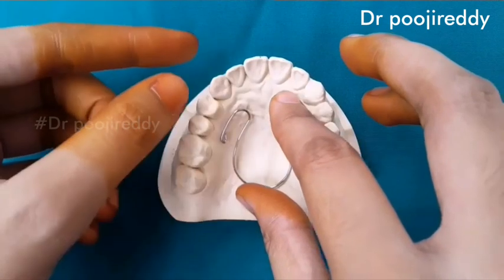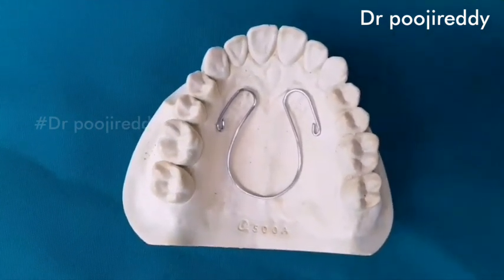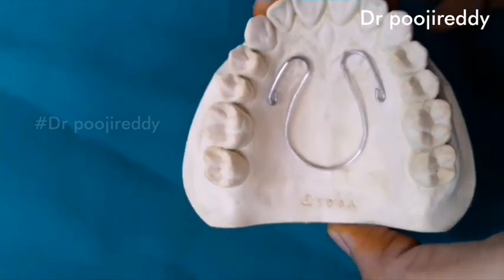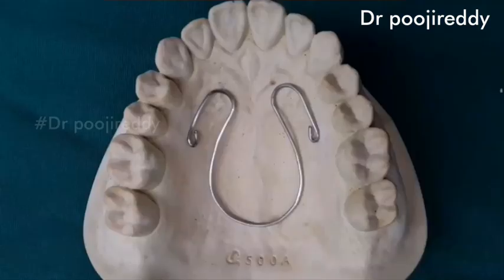You should modify the coffin spring according to the palate so that it will adapt well to the palate. See the adaptation of the coffin spring to the palate. See the perfect adaptation — and this is how the coffin spring looks like after fabrication.